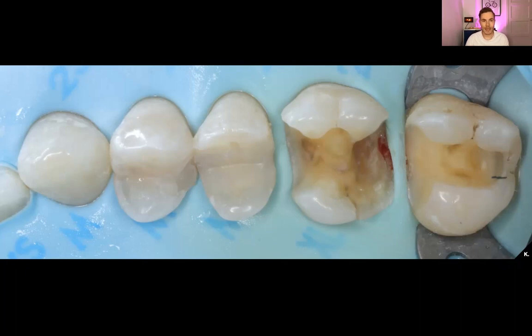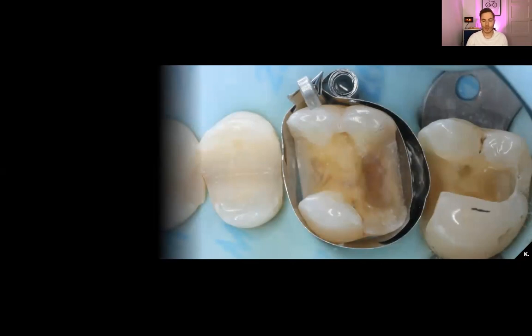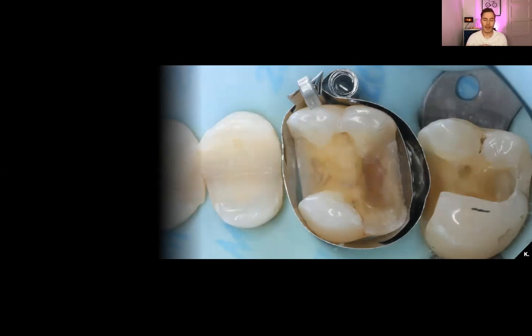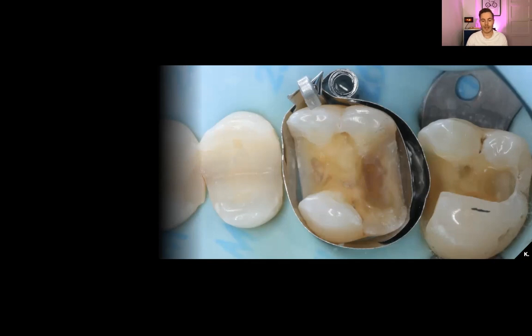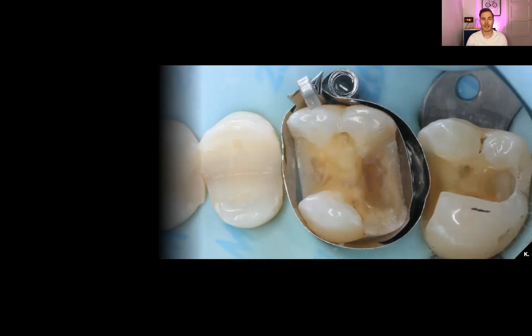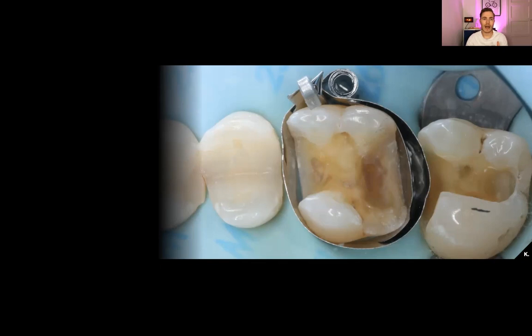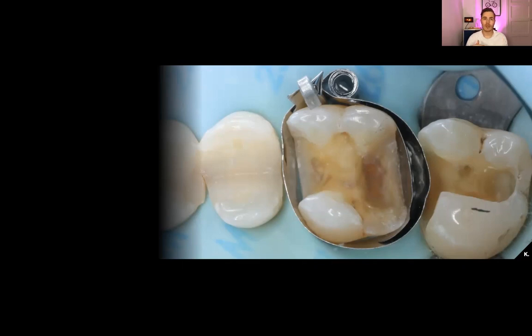I used a double matrix technique: an auto matrix and then a partial matrix band placed in between, so the auto matrix is my guide for my partial matrix. The partial matrix slides in between the auto matrix and the tooth, and I can use some PTFE to make sure it's packed properly — you can see the PTFE in between both bands. The margin is perfectly isolated and perfectly sealed, so now I can use a little bit of flowable or composite to raise this margin. On the mesial side there isn't as good a seal, but that's not really important since that outline was already higher than my rubber dam.